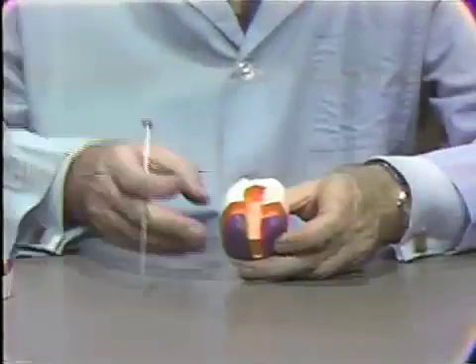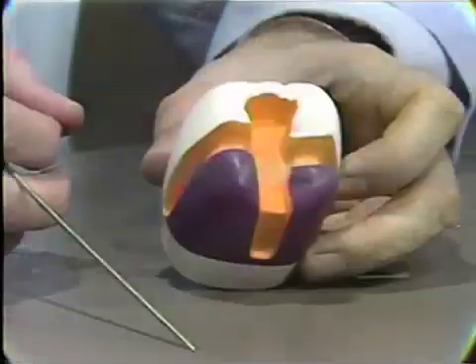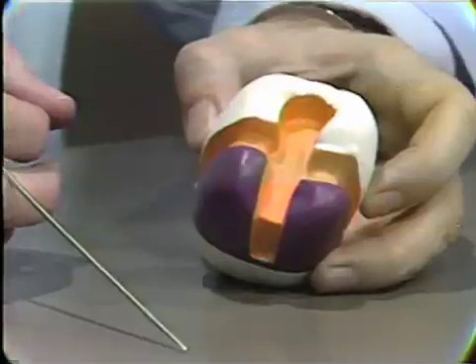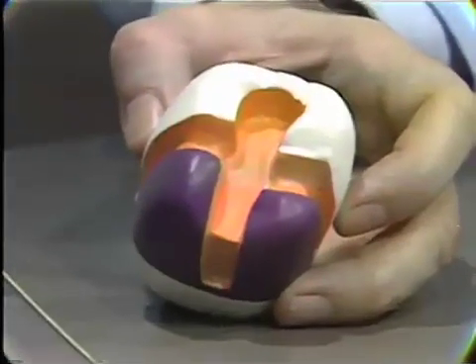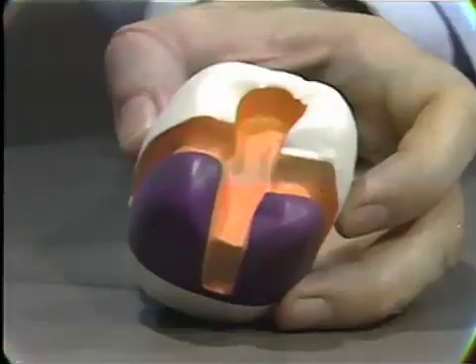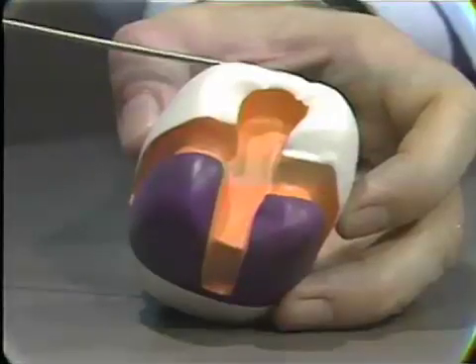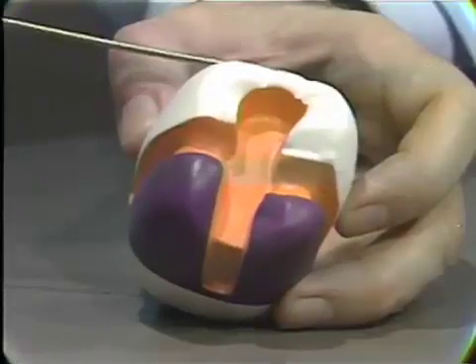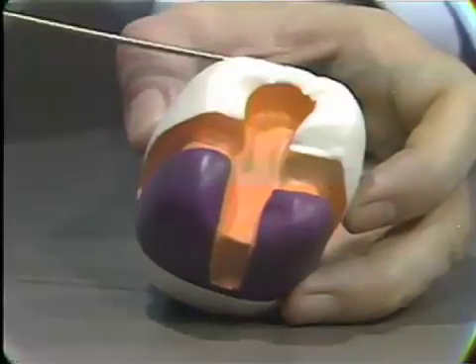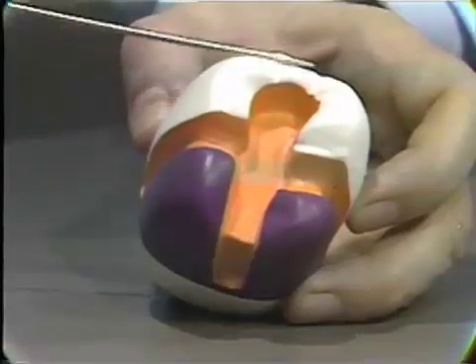Another modification of the three-quarter crown is the mesial three-quarter crown, or sometimes called the mesial half crown, and you see an illustration of this preparation here. It's usually done on a molar tooth, usually a mandibular molar tooth, and it's a particularly good preparation where for one reason or another you do not want to be involved in the distal surface of the tooth in doing the preparation. If there's no previous restoration, no caries here, and possibly a difficult contact relation on the distal or a difficult soft tissue relation, or a problem of an external undercut in relation to the adjacent tooth.